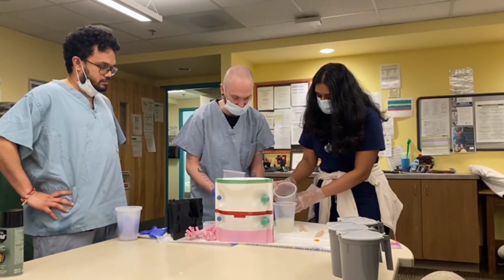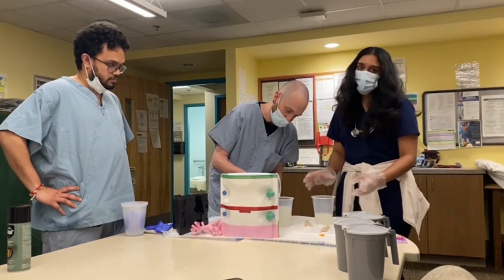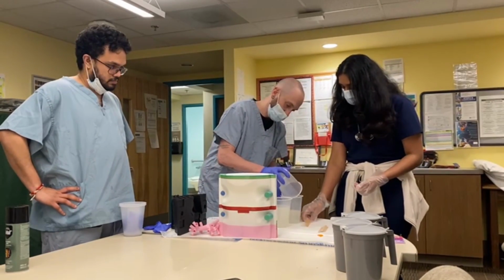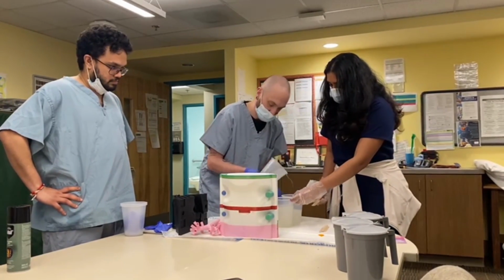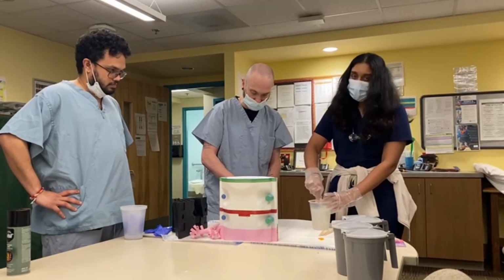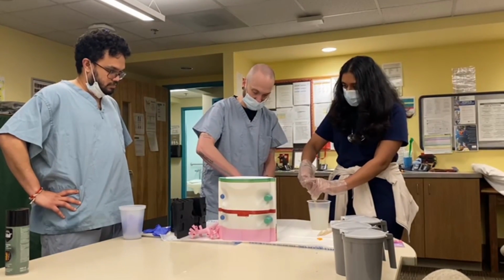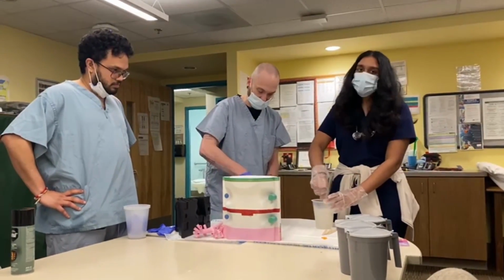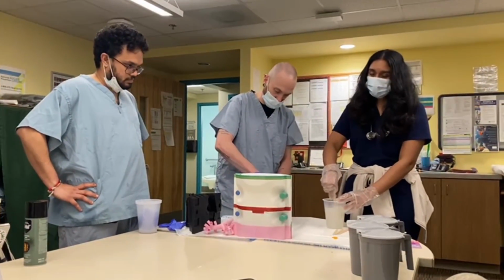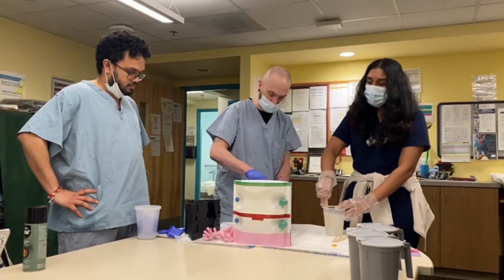So what we're doing over here is just trying to make sure that we've got as even a mix as possible by ensuring that we make sure they're mixed in multiple batches. The silicone has a setting time of about 5 to 8 hours at 25 degrees Celsius, which is about room temperature right now. But we can see how that goes. The top layer of the silicone that's exposed to air sometimes gets a little bit sticky, so we'll leave it until we see that it's set pretty well.